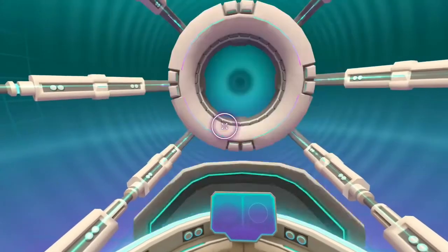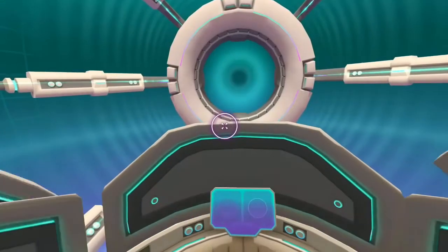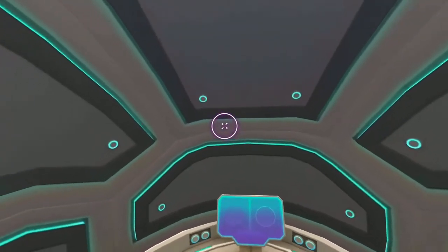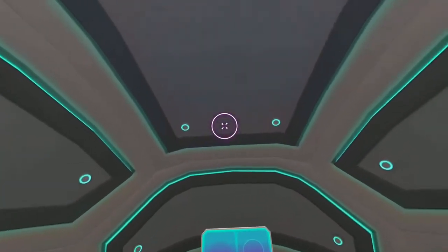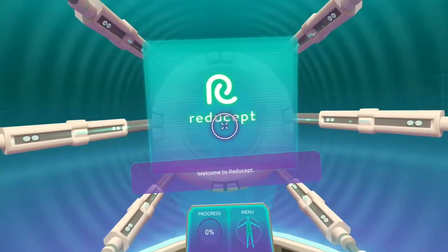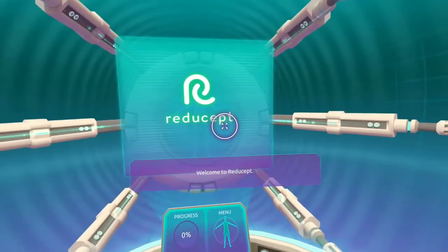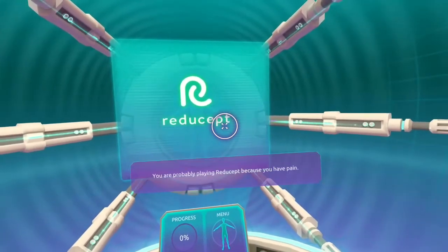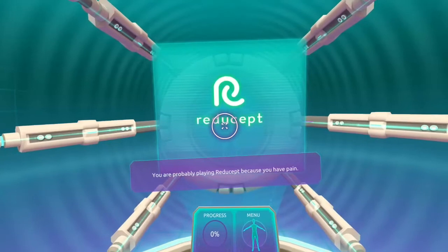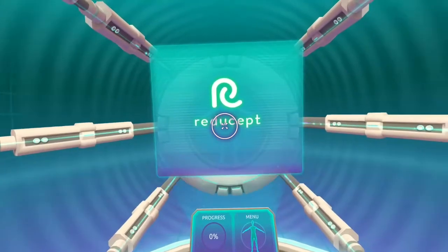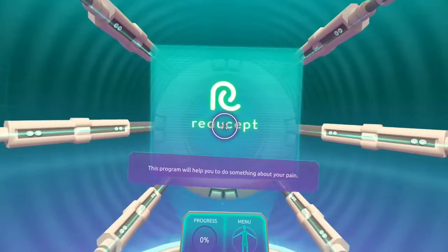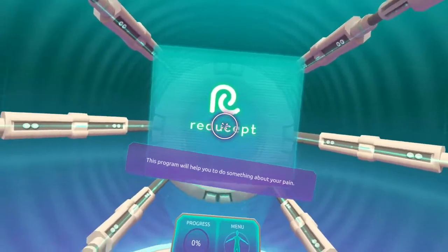Let's start at the beginning. Welcome to Reducept. You are probably playing Reducept because you have pain. This program will help you to do something about your pain.